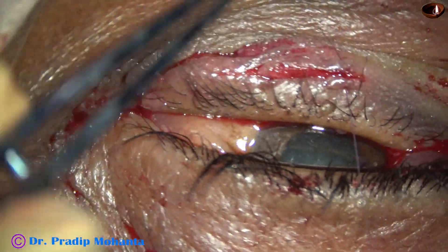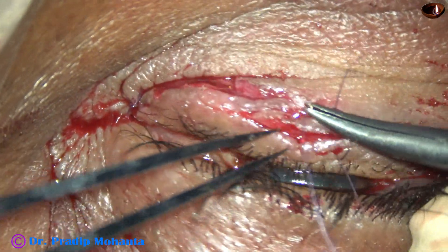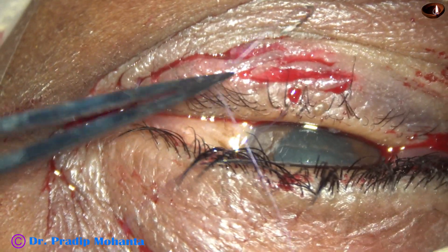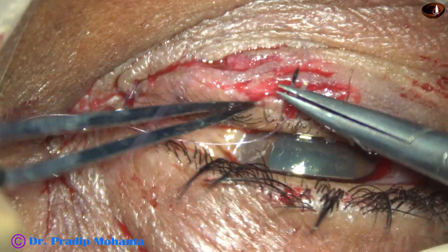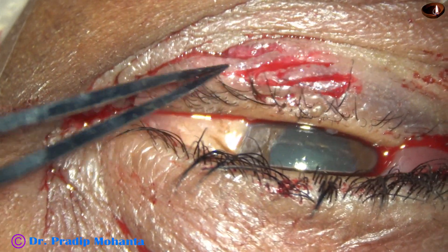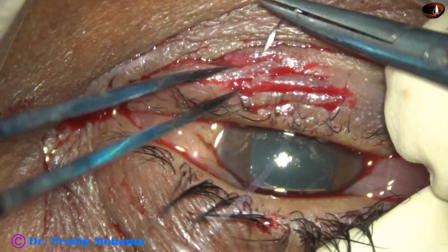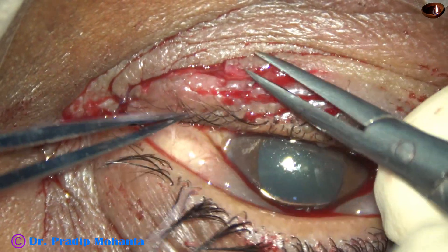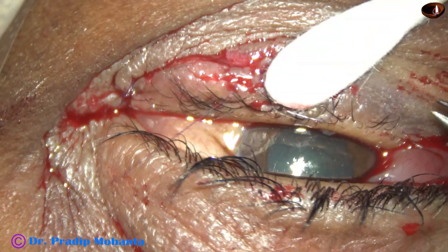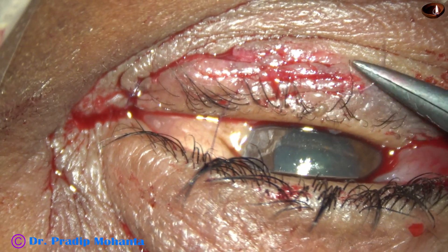First, repair this with a running mattress suture — no knots, just running mattress. And then finally, one more bite. And done. These two surfaces will be nicely opposed.